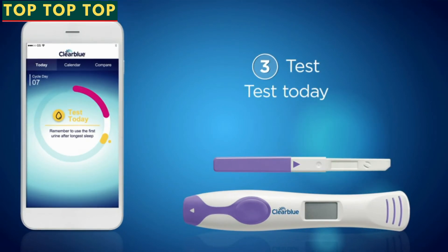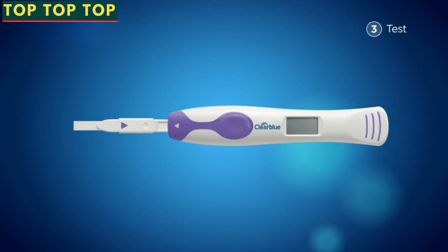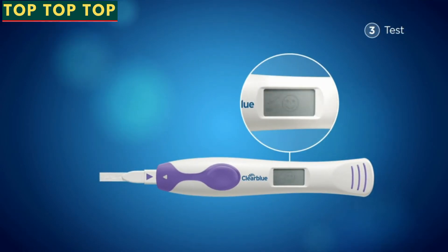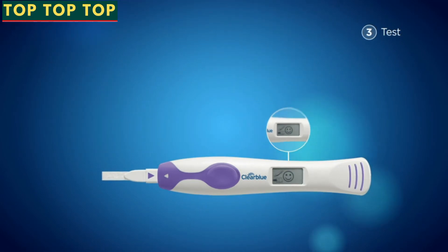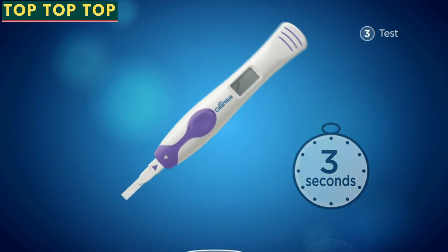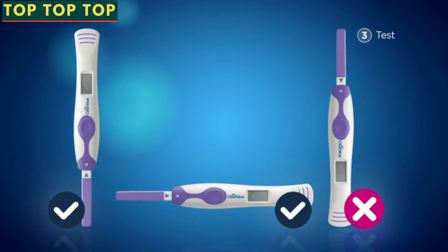Step 3: Start testing. The app will tell you when to test. Always test using the first urine after your longest sleep. Take a test stick out of its foil wrapper and remove the cap. Before testing, insert the test stick into the holder, lining up the arrows, and make sure you hear a click sound. The first time you use the test, you'll see some symbols flash briefly on the display — this means the holder is working. These symbols will also flash if you haven't tested for three days. To test, either place the absorbent tip pointing downward in your urine stream for three seconds, or dip it in a collected urine sample for 15 seconds. Replace the test stick cap, and remember to always hold the test with the tip pointing downward or lying flat.